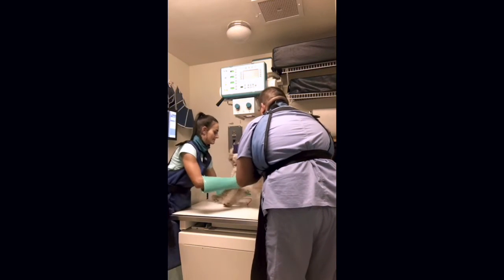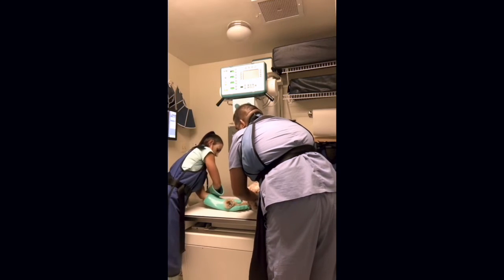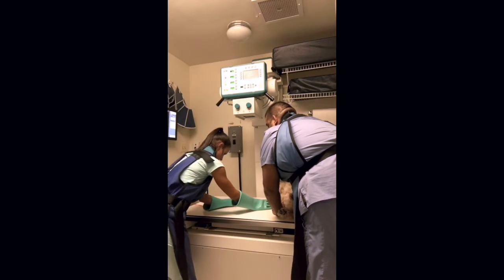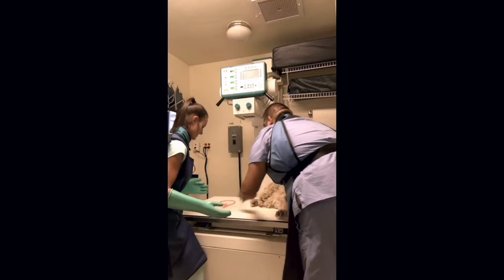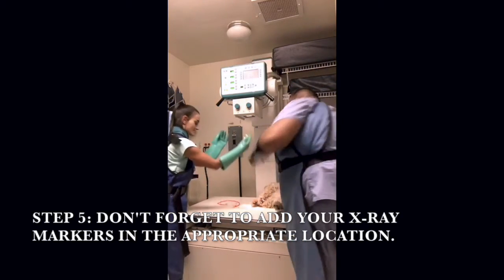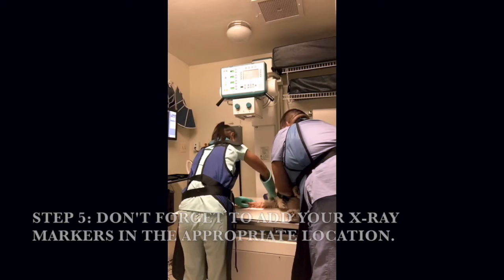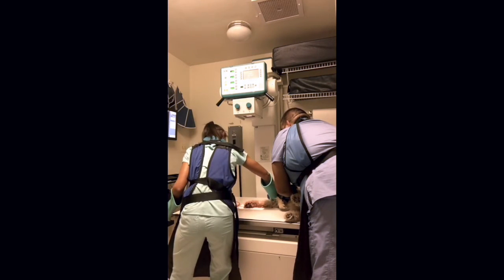When positioning the distal forelimbs, such as the elbow, the radius, the carpus, the metacarpus, or the digits, the patient is in sternal recumbency. You want to note that the terminology does change at and including the carpus. Thus, in two of the radiographic images captured in my video, the elbow is positioned as craniocaudal and the carpus is referred to as dorsopalmar when Charlie is in sternal recumbency.